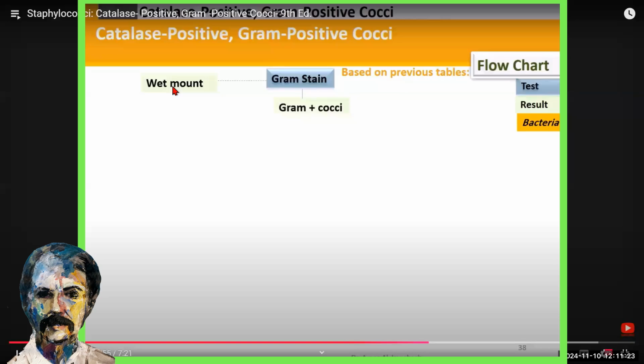And usually Candida albicans under the microscope is quite larger than the bacteria, because the bacteria is very small, but the Candida albicans, the yeast, is very big, and it has a greenish fluorescent color, not like the bacteria. So you can tell exactly when you look under the microscope, this is yeast. It's not staph.